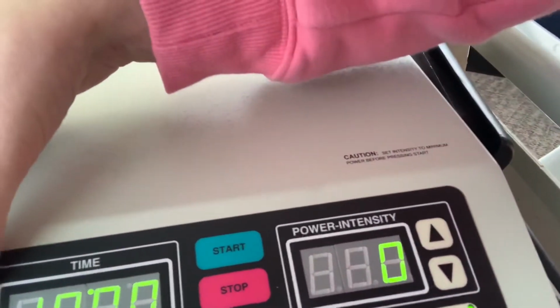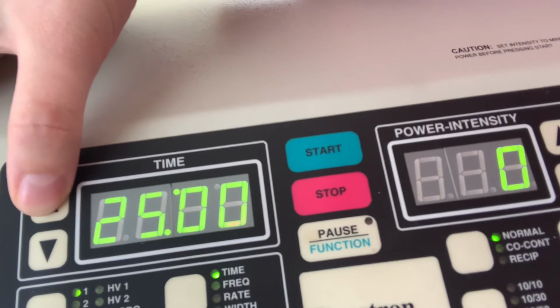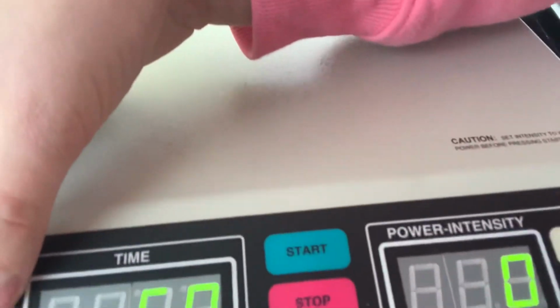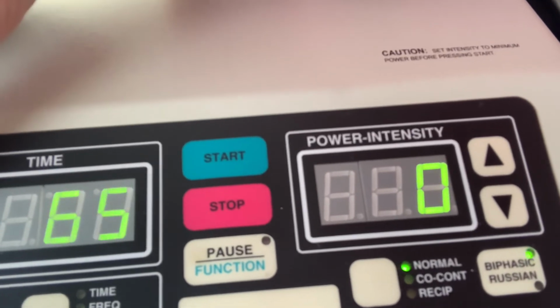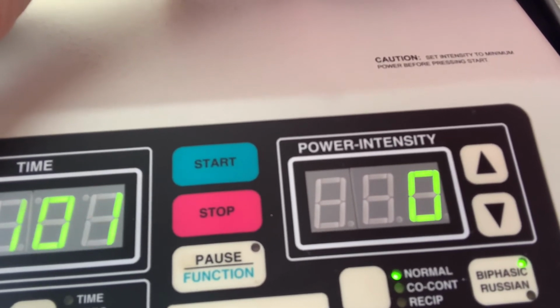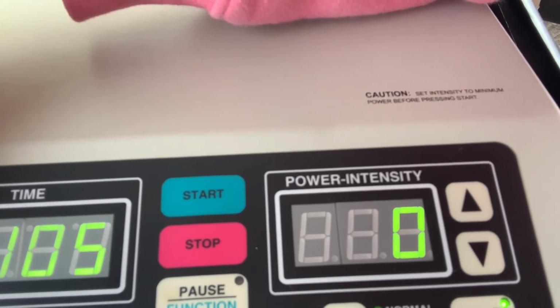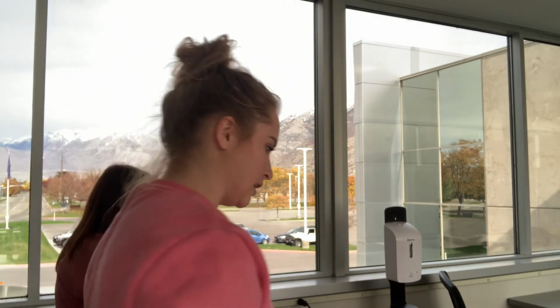So for time, we're going to increase that to 30 minutes. And for the rate, we're going to increase that to 100. And then for the width, we're going to decrease that to 100. Okay, and then as far as intensity goes, we're just going to turn it up until our patient here feels a little tingling or buzzing in that knee area.